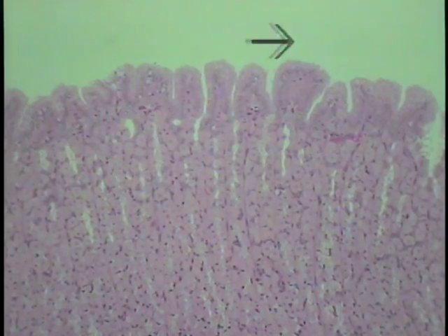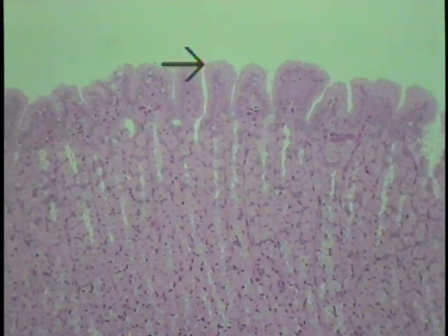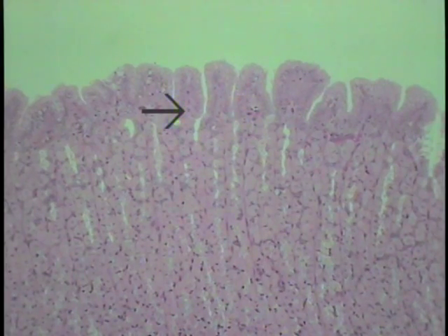This is a low power field of a portion of the gastric mucosa taken either from the fundus or the body of the stomach that is characterized by the oxyntic or gastric type glands. The arrow indicates the position of the gastric lumen, and these small invaginations coming down to about this level are the regions of the gastric pits. As will be shown in just a moment, they are lined by a typical simple columnar type of epithelium that produces mucin and is considered a typical mucin-producing type of gastric lining epithelium.